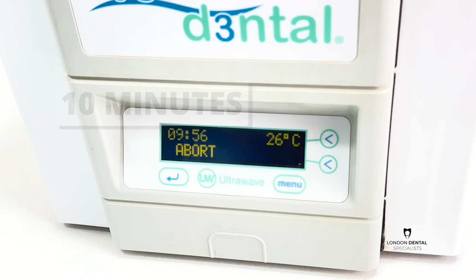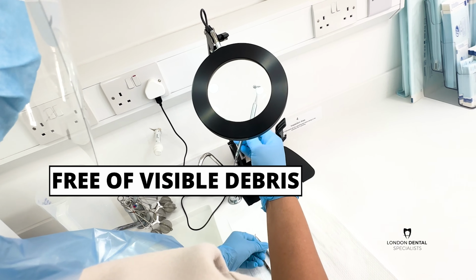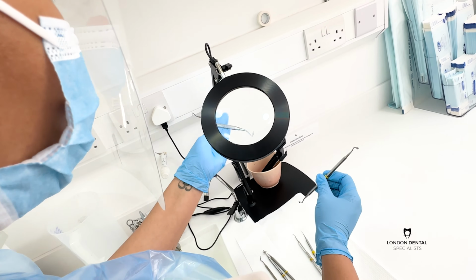As you can see, the cycle is complete. Instruments are still submerged, and we're now going to take them out and rinse them under cold water. Now the instruments have been submerged and rinsed to get all the detergent off. She's now going to dry with this lint-free cloth to ensure that there's no lint left on them. There's this magnifying light that Ghislaine is going to use to inspect under magnification that the instruments are free of all types of debris. So that's exactly what she does for every single instrument.